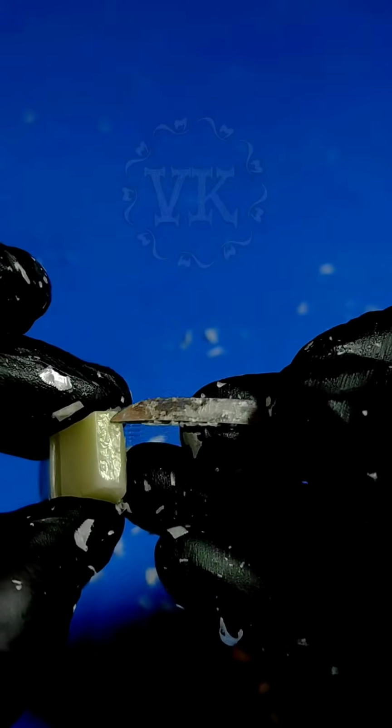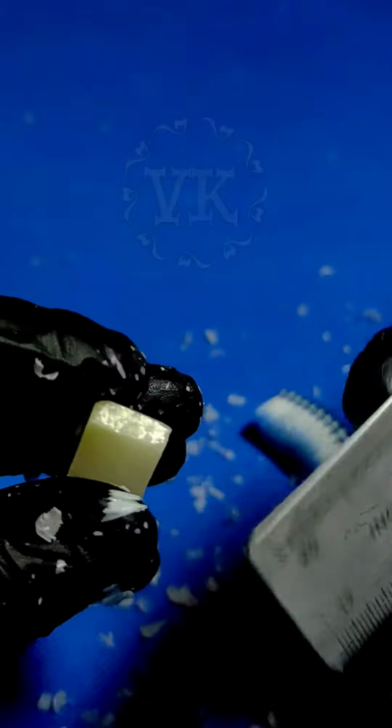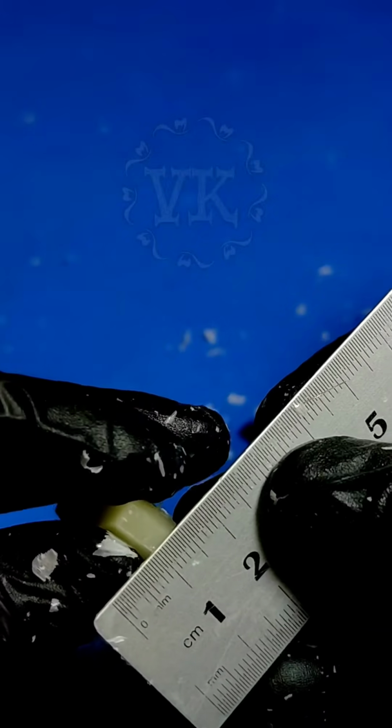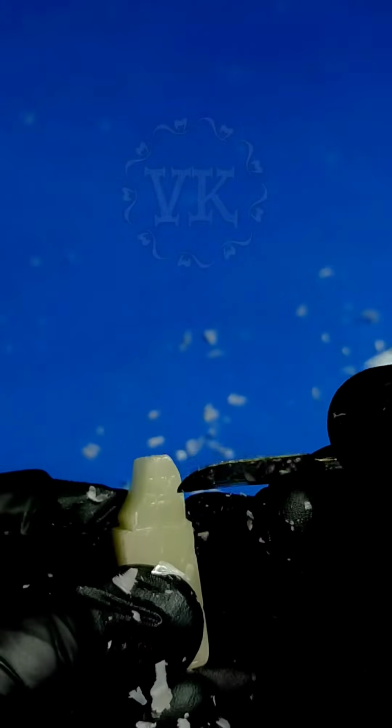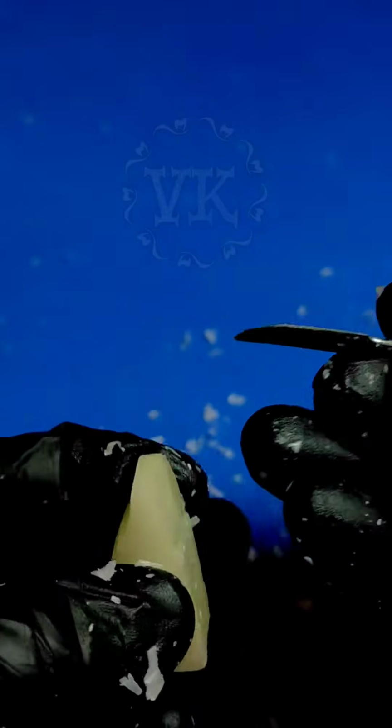More wax left behind. You see the occlusal surface, it's too flat. It should be just about half a millimeter to 1 millimeter in width. It should not be so wide like this. Now this is almost, how much? It's about 3 to 4 millimeters. That's too wide. Your incisal edge is not a surface, it's more like a small ridge. So it's just like half a millimeter to 1 millimeter, more on the smaller side, not on the 1 millimeter side.